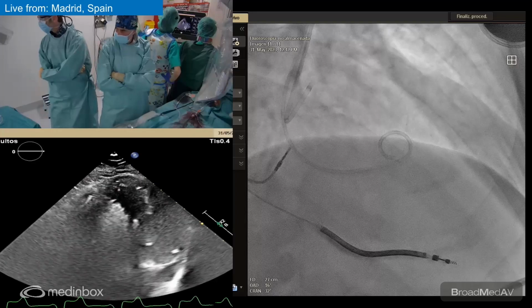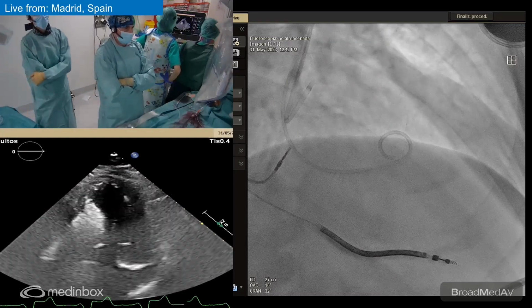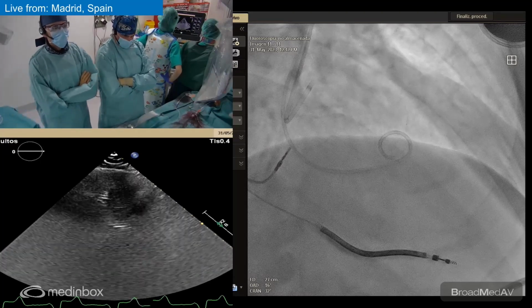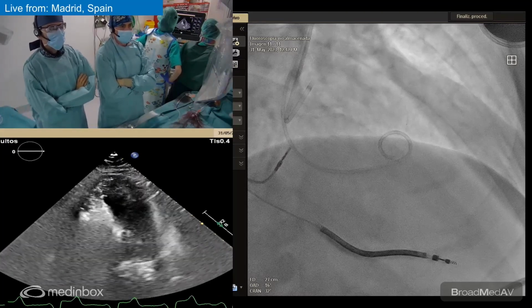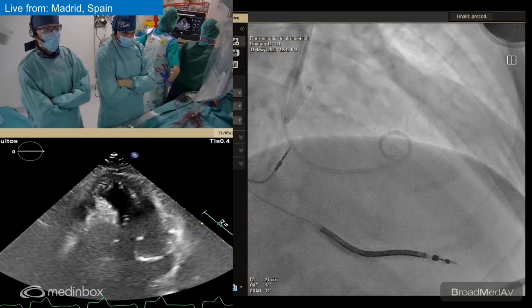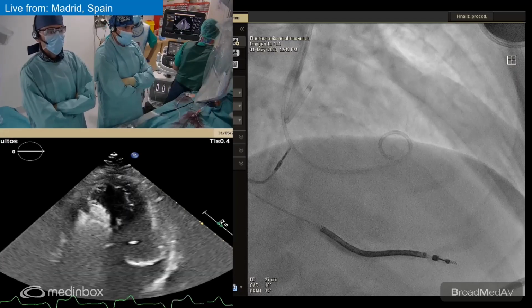Any questions, Borja, from the audience? So as you can see, it's not the most difficult procedure we do here, but you have to be very precise with patients step by step, because if not, you can have a complication.